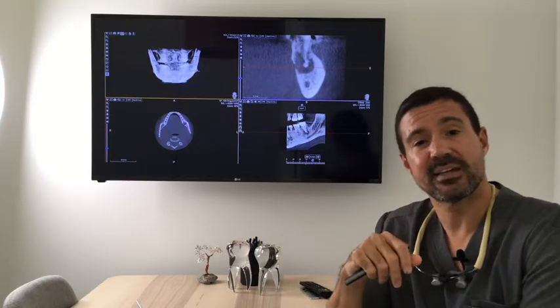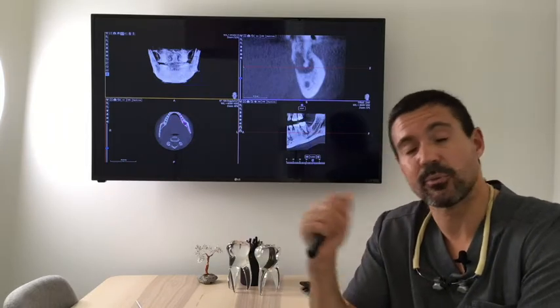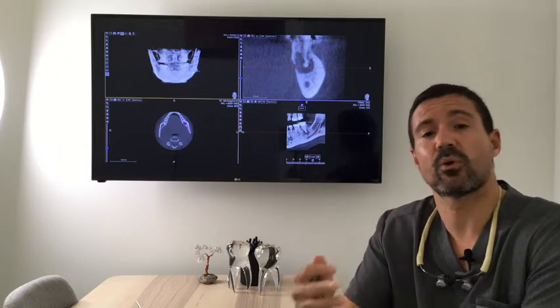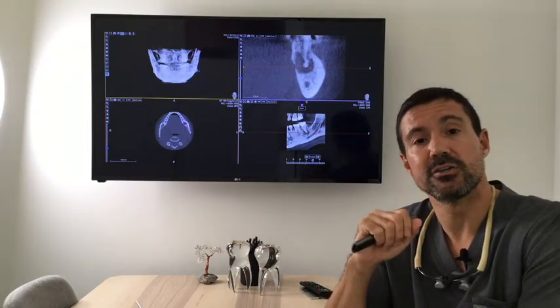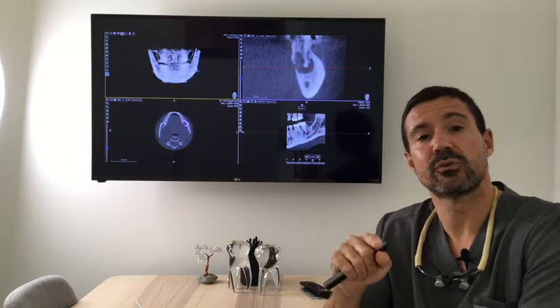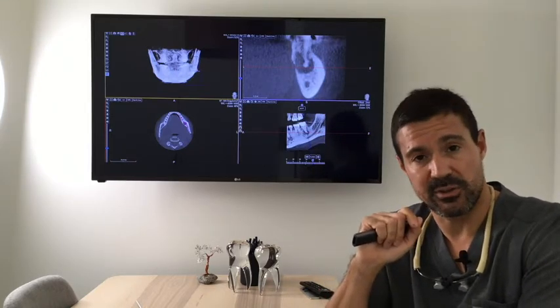So I hope that in this case you learned a little bit and I had the opportunity to share with you a little bit about my cases. I'm going to keep posting cases on a daily basis, and I hope that you enjoyed and learned new things about the use of the CBCT as a very important tool for not only implant planning but also for diagnosing and communicating with the patient.